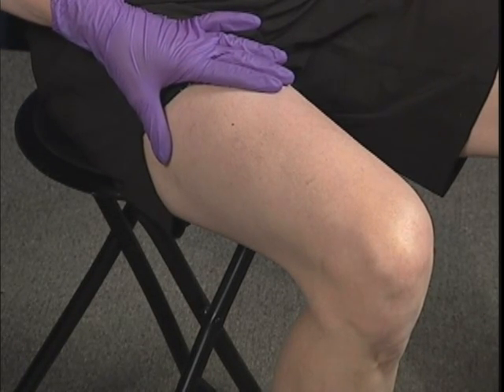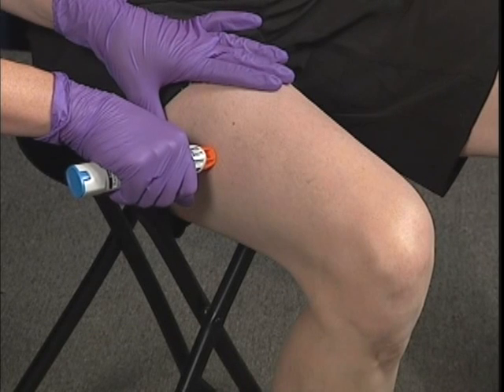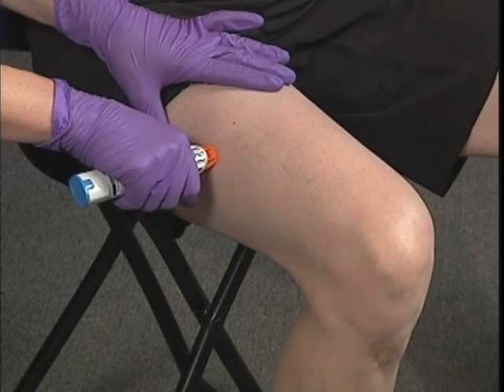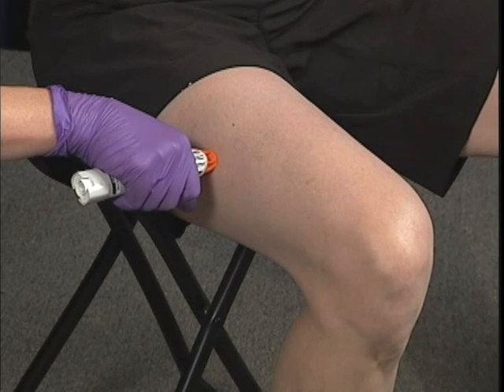Grasp the auto-injector by wrapping your fist around the unit barrel. Never place your thumb or finger over the ends of the auto-injector. Place the needle end of the auto-injector against the prepared site on the lateral thigh at a 90-degree angle and remove the protective safety cap.